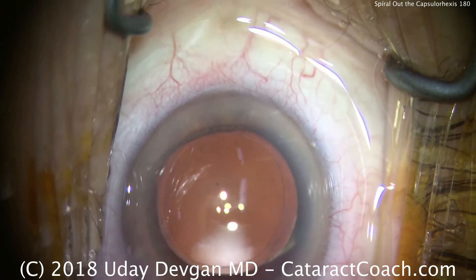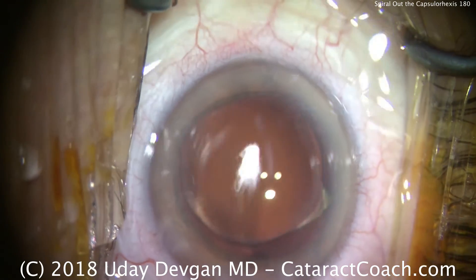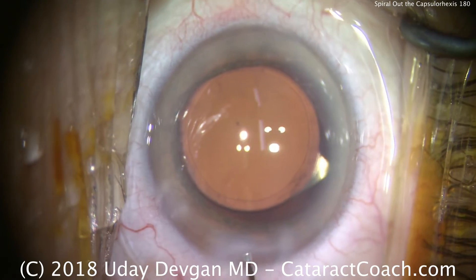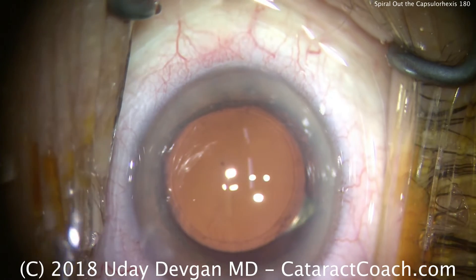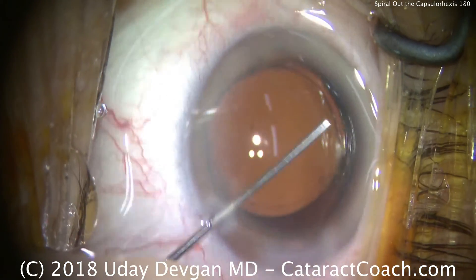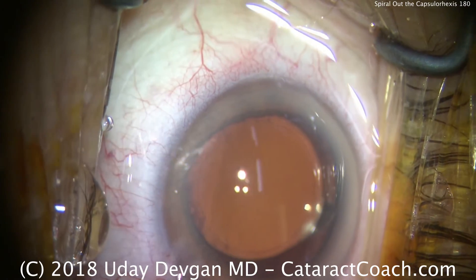If you're a novice surgeon learning capsulorrhexis, try the technique of spiraling out — starting a little bit smaller and then spiraling it to a bigger size. And remember, you can certainly go past the 360 degree mark. Once you have that complete first turn, you may need to go a little further, another halfway around, just to get the appropriate size.